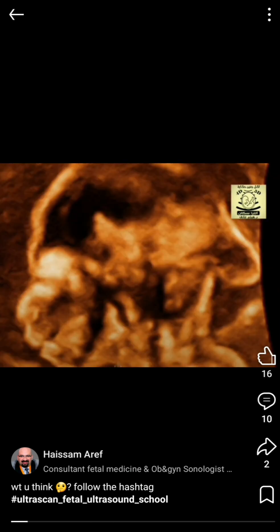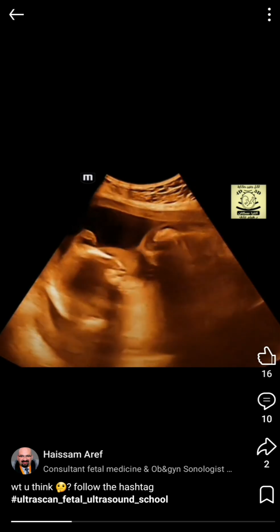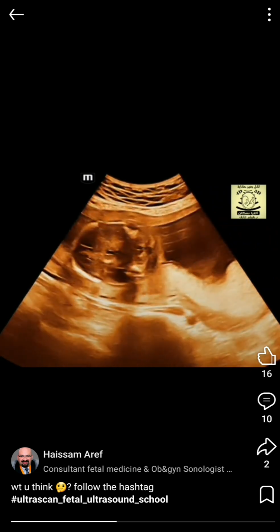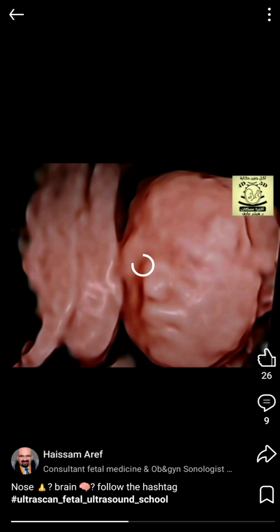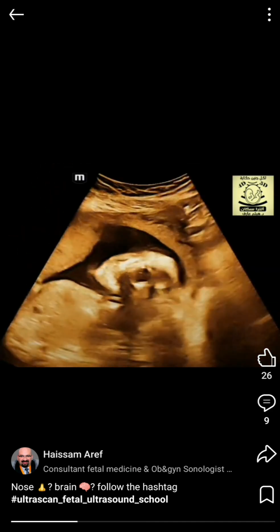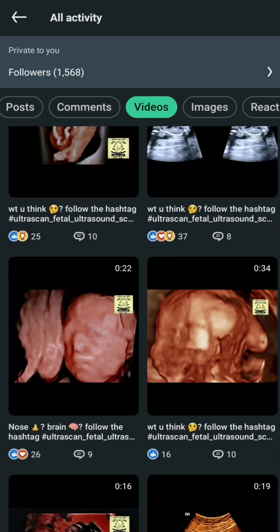The encephalocele here was apparent in the render and is carrying with it part of the brain and causing triventricular hydrocephalus. This case also, I guess we did not comment upon, which was a case of cephalocele with holoprosencephaly, single nostril with an apparent holoprosencephaly in this case. Single nostril with holoprosencephaly. I guess it was very apparent.